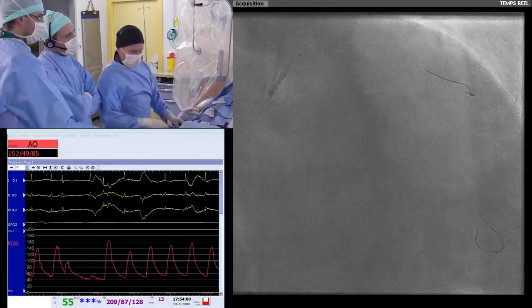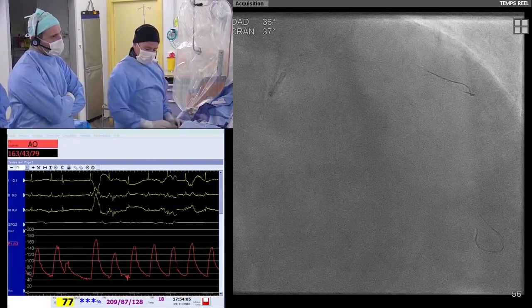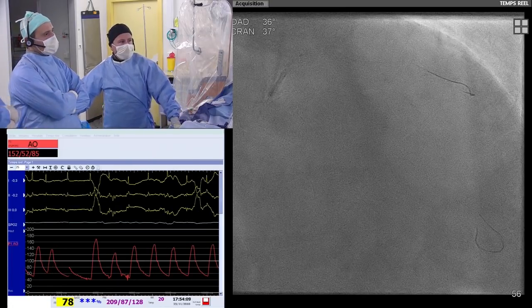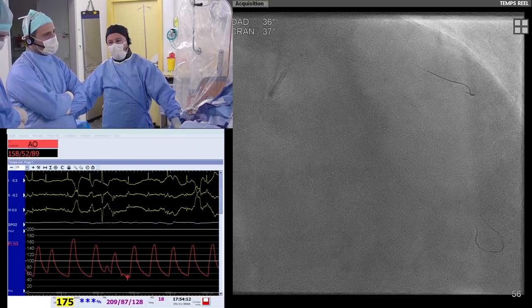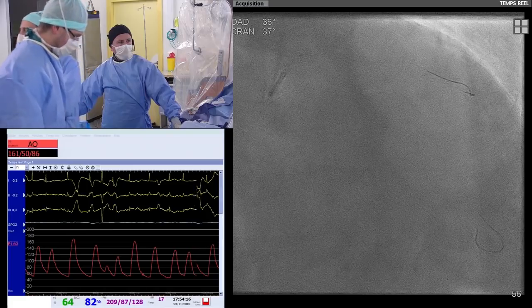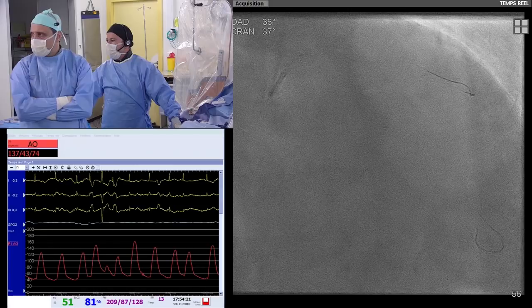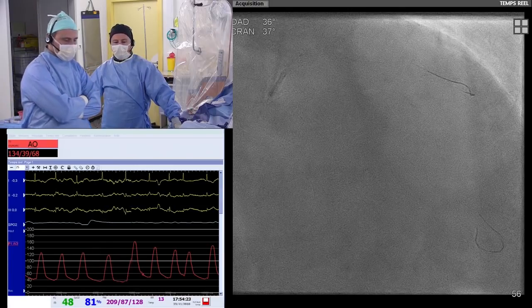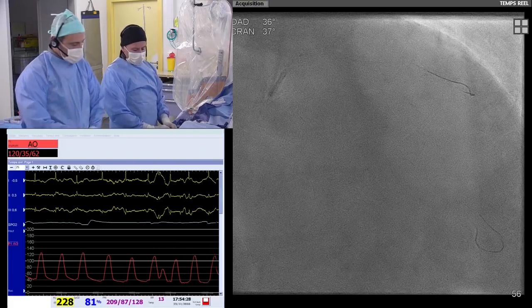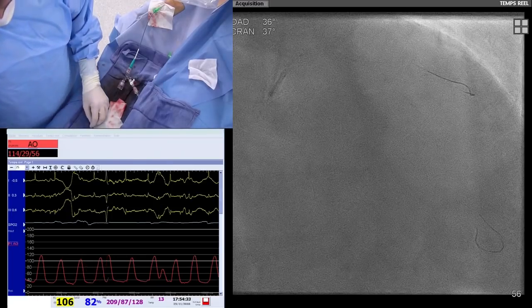So if you're okay, we will try to advance the stent in this distal lesion, in this long lesion. In case of failure, we can use a guide catheter extension. I think we will see, because due to the left main lesion, I hope we will succeed to cross this lesion with the stent. You know, there are 2 wires, the rota wire which is inside the LAD, and also the other Samurai in the diagonal branch.